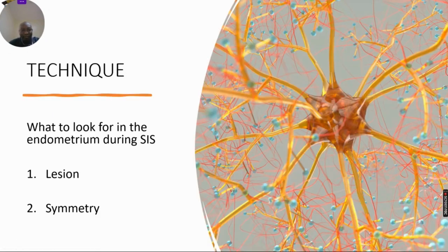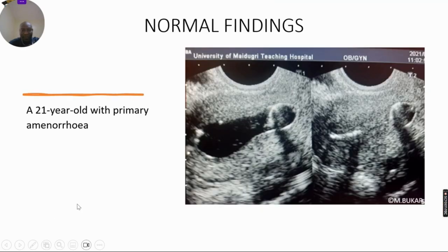In saline infusion sonography, you look for endometrial lesions and also the symmetry of the endometrium. This is a 21-year-old with primary amenorrhea. You can see the catheter balloon, the myometrium, and any myometrial lesions can also be picked. Look at the endometrial cavity — there is no lesion within the endometrium. These are air bubbles during introduction of the fluid. After the procedure you can see the air bubble clearly delineating the endometrial cavity.